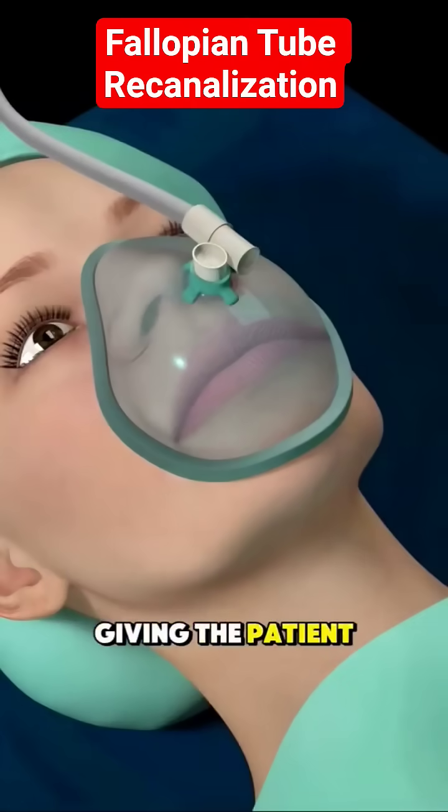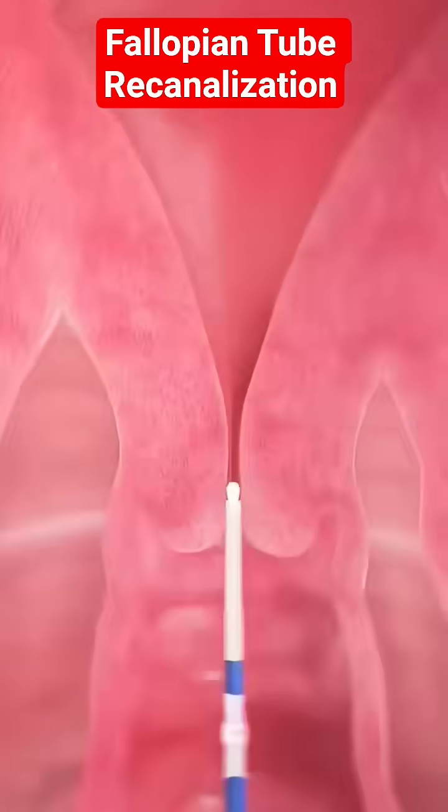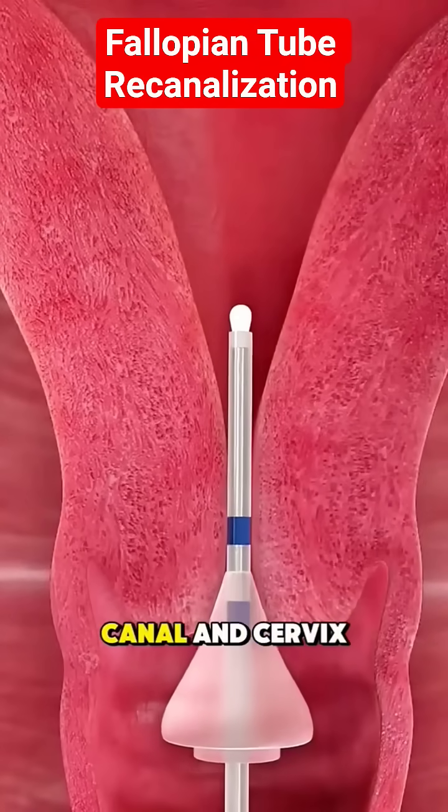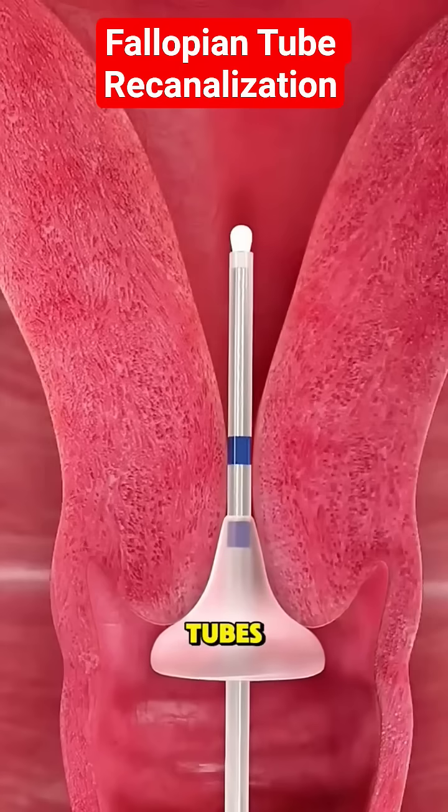It starts with giving the patient light sedation or anesthesia for comfort. A thin tube called a catheter is gently inserted through the birth canal and cervix, reaching the opening of the fallopian tubes.